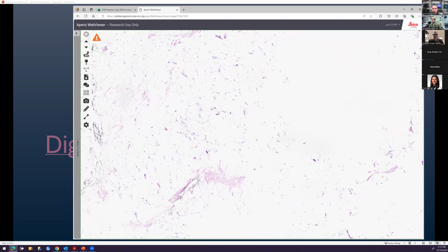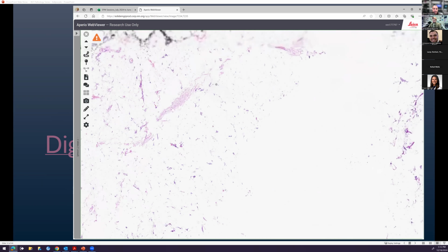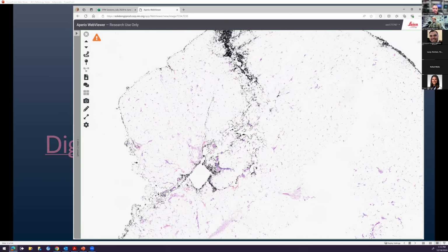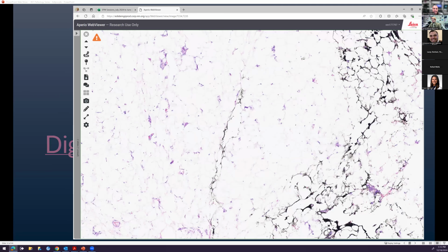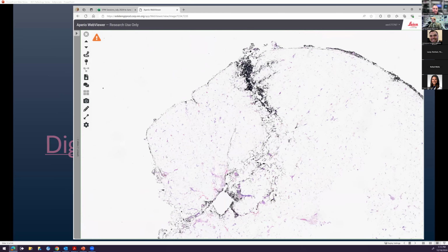Perfect. All right. So exactly, we're looking at mature adipose tissue. I already told you that I don't have any scanned lipomas. So you might wonder why I am showing you this case here? Well, there's something else that's happening in this lesion, and I'll show you that.